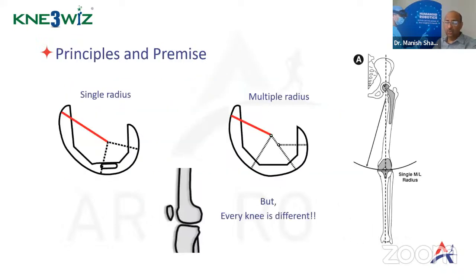But then we know that what we are replacing has a different geometry. It does not follow the natural geometry. Each knee design is different. A single radius design does not behave the same as a multi-radius design. Some have a single mediolateral radius as well. Thus, putting them all into a natural pre-arthritic alignment might not be the ideal solution for everyone.